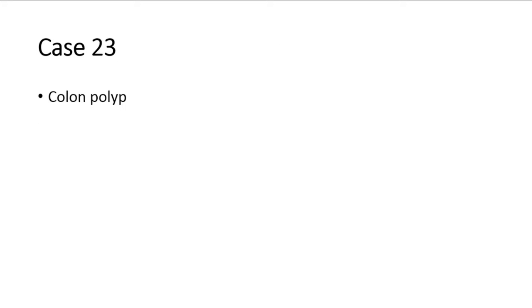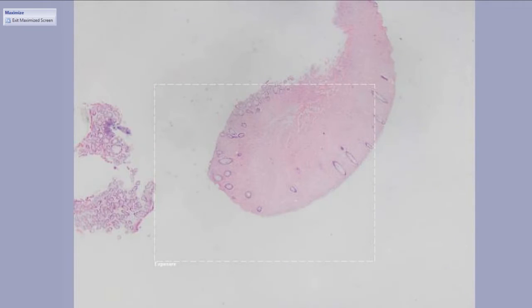All right, moving on to the colon, which is going to have about as many cases as the stomach. Colon is a heavy hitter, and we're going to start with a bunch of little polyps. These are not uncommon, and they tend to cause consternation, even though most of them don't actually matter too much in terms of implications for the patient.